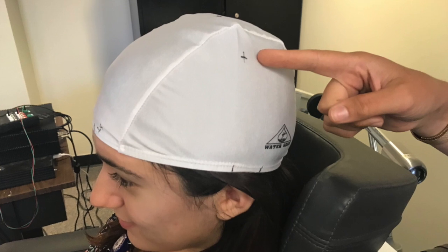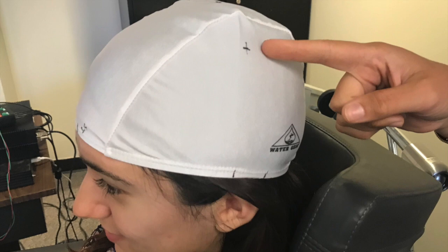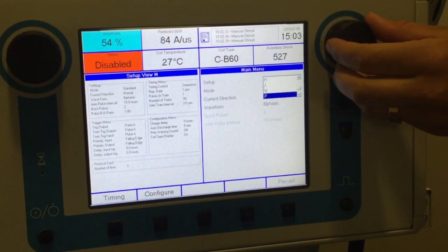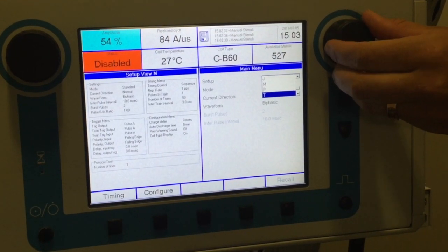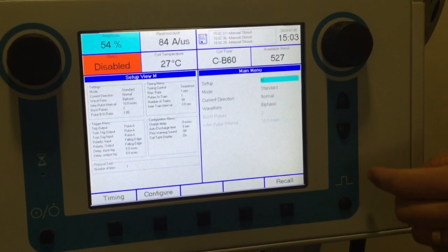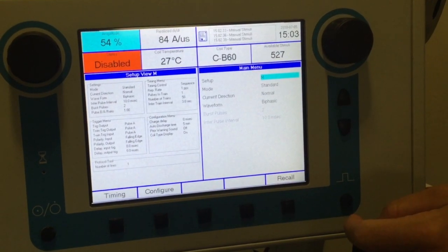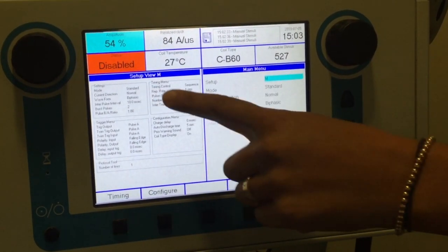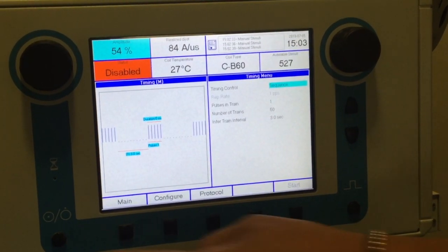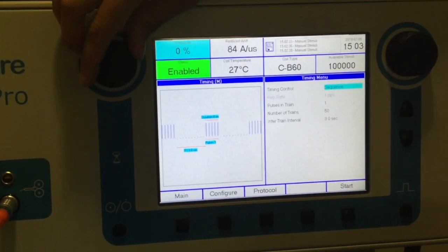With the use of the swim cap, we'll be able to start in the same location every time. When you're ready to begin using the machine, press the main menu. On the setup menu, scroll down until you find the letter M. Underneath, you'll see a button that says Recall. Make sure the setup menu on your left changes to the letter that you've chosen, and then press Timing. Enable the machine to your left, and raise the amplitude to about 50%.